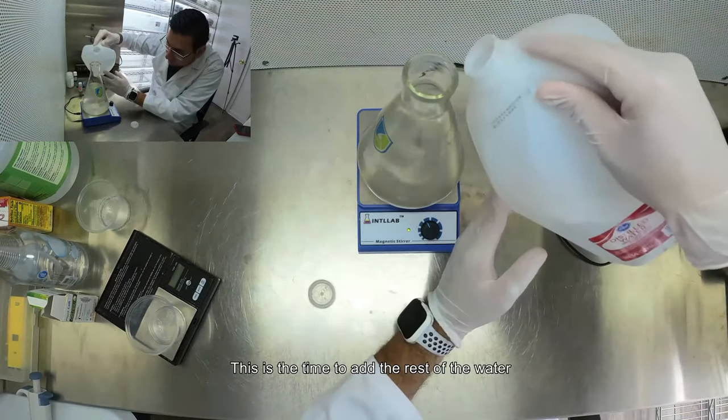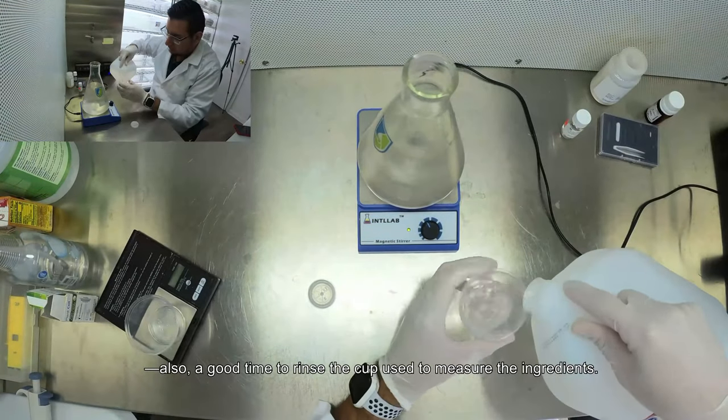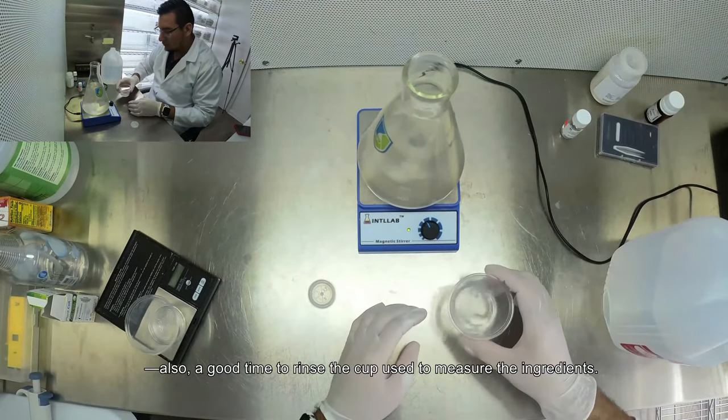This is the time to add the rest of the water — also a good time to rinse the cup you used to measure the ingredients.